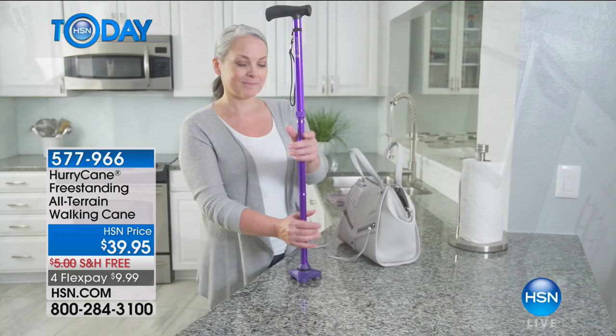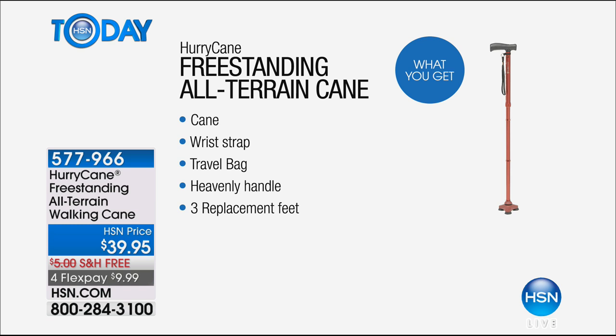We are going to include with this the cane, a little wrist strap, and a travel bag to carry it wherever you go. What we call the heavenly handle, which is so comfortable — remember that ergonomic grip, which makes it a really comfortable cane in the hand. And most importantly, you're going to use this for a while, so just like your sneakers, rather than make you buy a whole new cane, we're going to give you replacement feet.